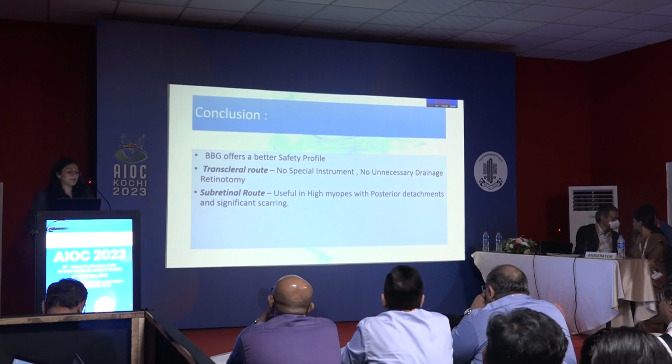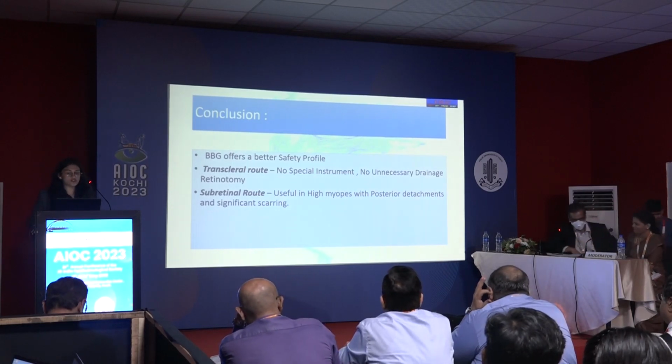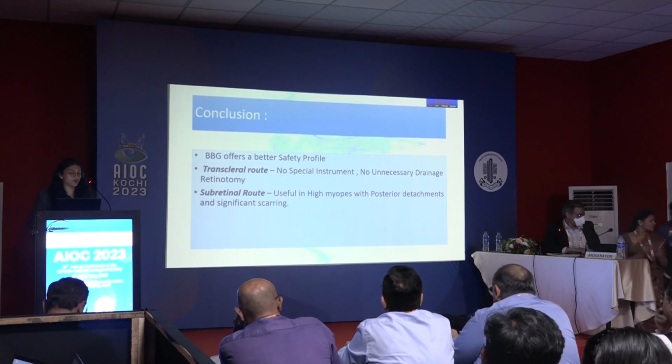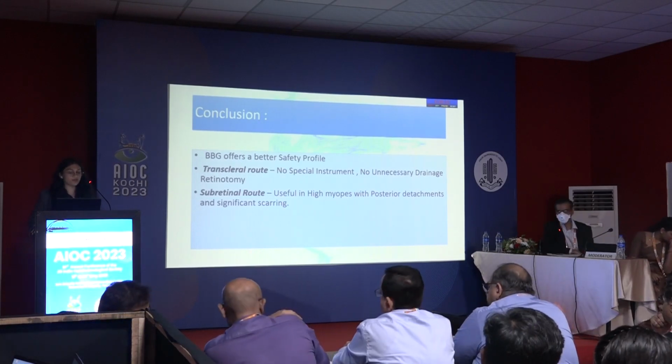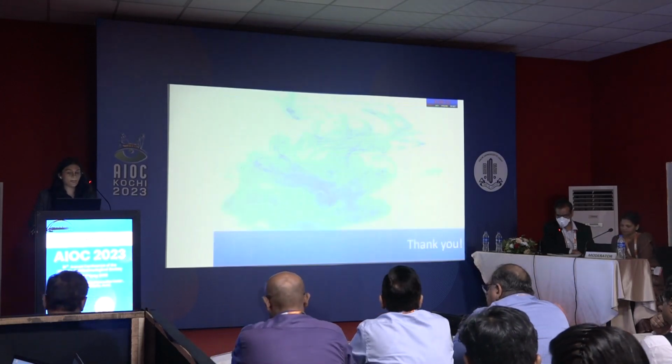To conclude, BBG offers a better safety profile. The transcleral route requires no special instrument and no unnecessary drainage retinotomy. The subretinal route could be useful in high myopes with posterior detachments and significant scarring. Thank you.